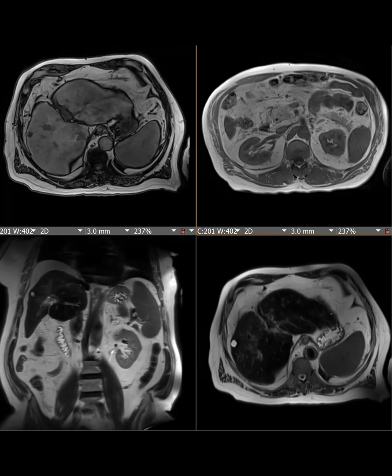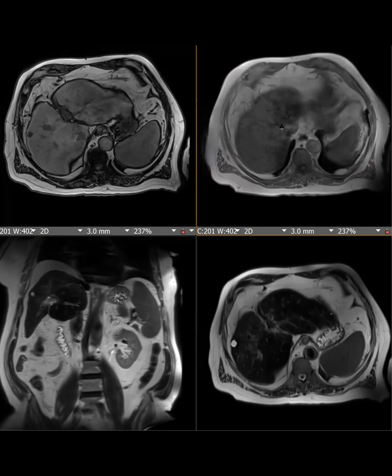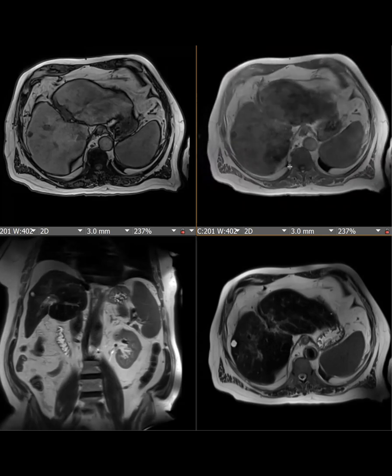Again, as I said, this is not a very challenging case, but a case that was instructive, and I wanted to share with the group. This was a 66-year-old male with alcoholic cirrhosis and long-standing history of hepatitis B, and this was an MRI that was performed for evaluation of hepatocellular carcinoma. And fortunately for the patient, there was no hepatocellular carcinoma, but there were in and out of phase imaging. On in phase, you can see there are multiple areas of decreased signal, which is not present on out of phase. These areas do not show any enhancement. And do people know what this is?